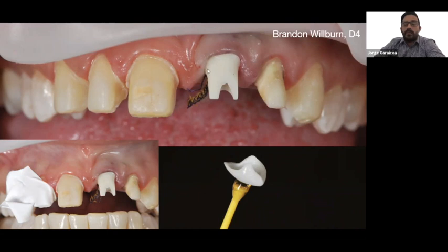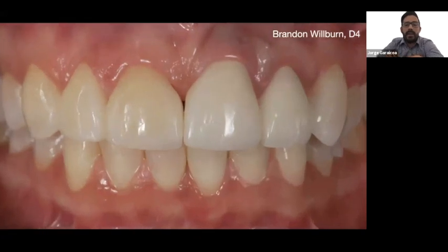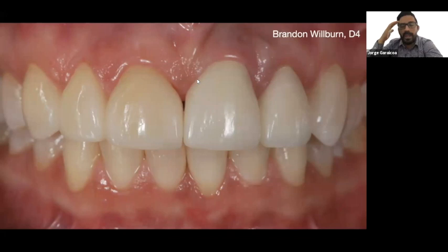You need to make sure you put the cord around, and then you use the cement to cement the restoration. We're also going to talk about some cements later on. Here's the final case. We had some issues in terms of matching, and I've been discussing this case with some of my colleagues and with the student, because there's a lot to learn from it, things that we can improve. But you can see that if you are careful enough packing that cord around the gingiva, you will be able to have a very clean margin and not a lot of excess. Another thing to plan is how much cement you put in that crown, and I will show you some tips too.